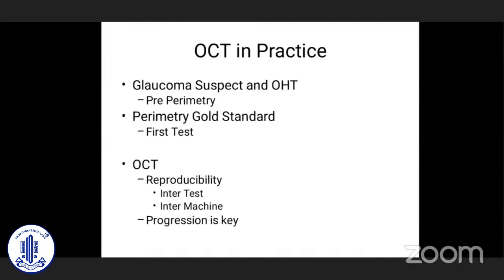on field testing. Having said this, because our audience today is mostly general ophthalmologists and residents, I must caution you that perimetry still remains a gold standard. Unless you do the perimetry in a glaucoma suspect or ocular hypertension, how will you know if there are field defects? When you do it first in a so-called glaucoma suspect, then that patient does not remain a suspect for glaucoma anymore. If there are field defects on the first test, then that patient becomes early to moderate glaucoma depending on the field defects that are available.